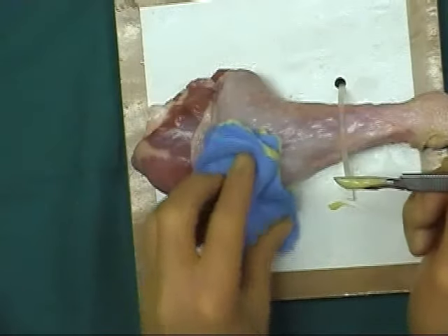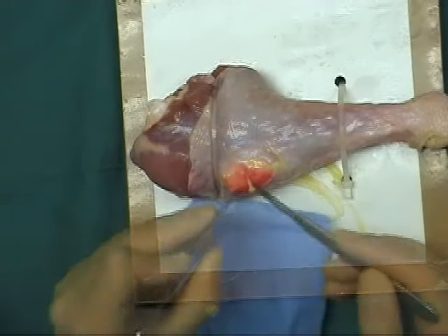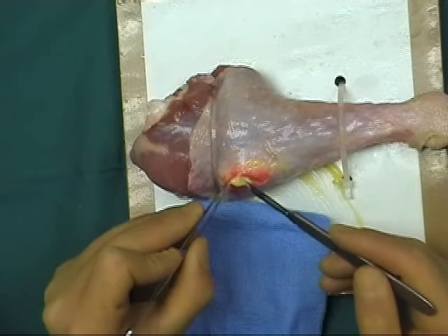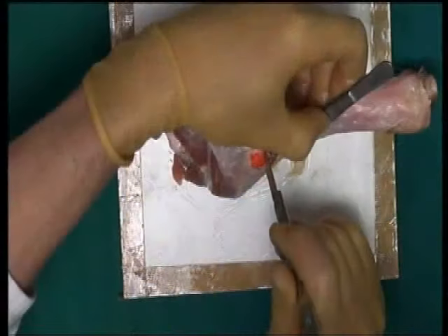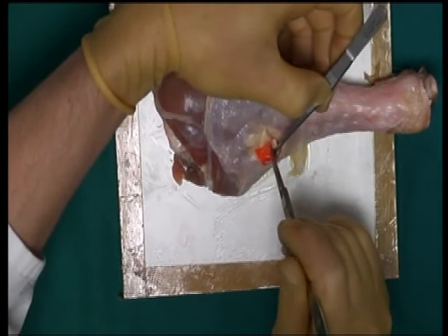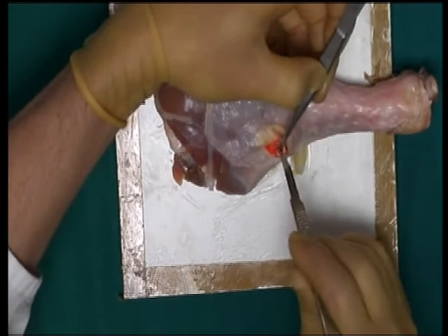We are left with a cavity which still contains pus and an overlying linear skin incision. It is vital to ensure that the skin incision cannot close over. This can be achieved firstly by making a generous skin incision. Alternatively, an elliptical incision could be formed or, as in this demonstration, a cruciate incision made.